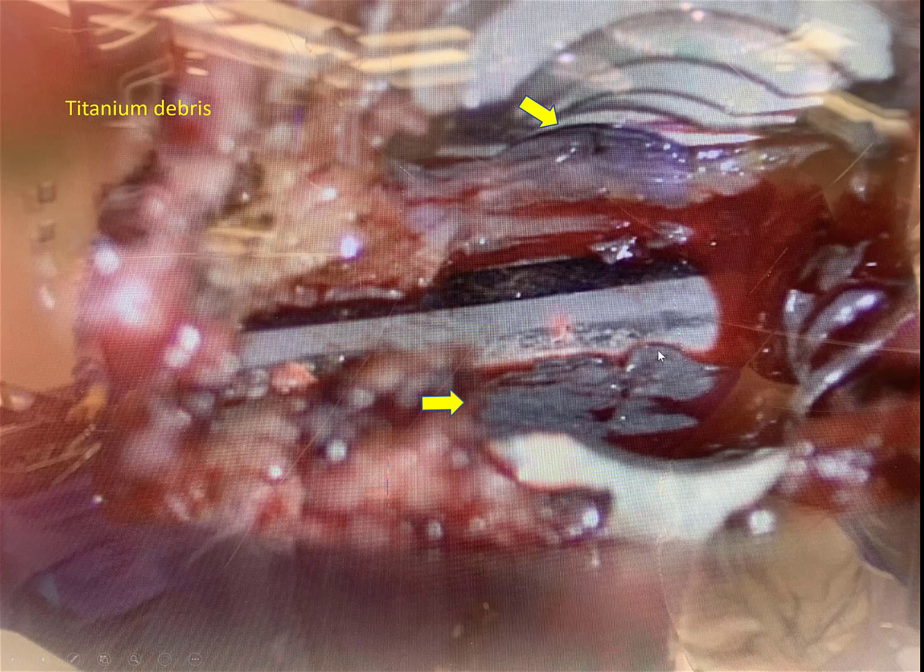And when I took the cap off, you see this debris? This is titanium debris that was sheared off, and it's got soft tissue associated, very similar to the metal that you see in total hips. Metallosis, right. And you can see this line here, where the cap was rubbing against the rod. You can see it went like 2 centimeters. It moved a lot. You need to remove this. You can't leave it in because it increases the levels of ions in your blood, like in joints, right? When you revise a joint, you try to remove it all?